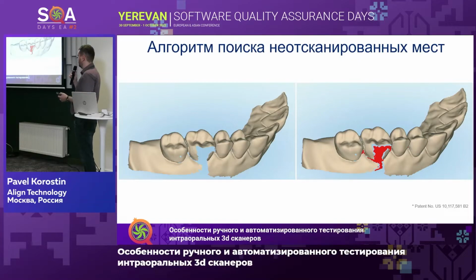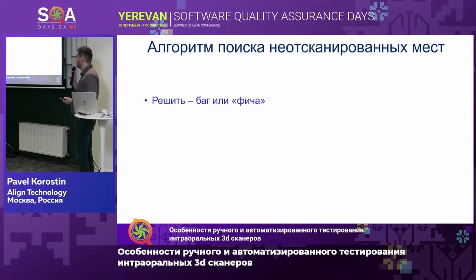Another thing to consider is that after scanning, there is a post-processing, post-rendering stage where such small imperfections can be additionally drawn. We have looked at it, and in this particular case, we have decided not to improve it. It's not a defect of the algorithm; it's an acceptable bias, and our testers sometimes make decisions like that when they compare the output with what we receive from our testing.